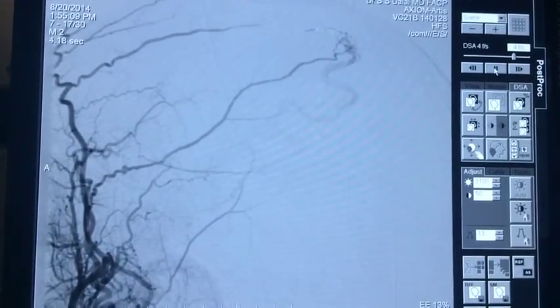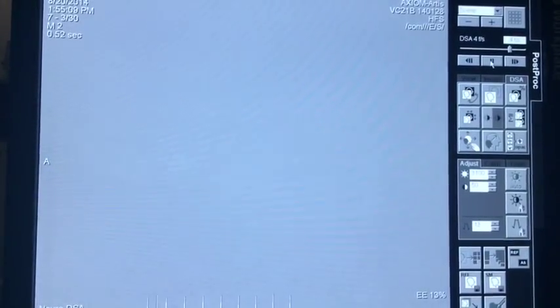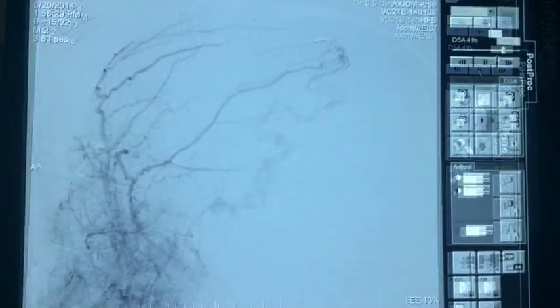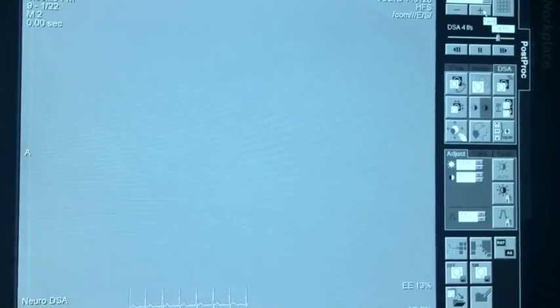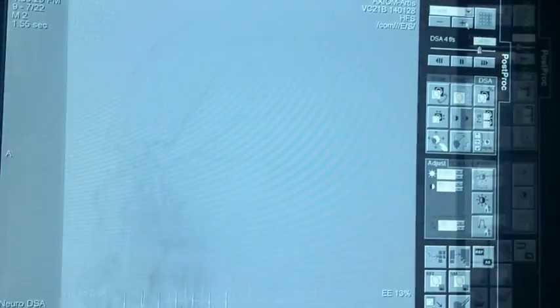But the fistula continues to fill from the middle meningeal artery. So we continue to inject Onyx on this patient. This is an oblique projection which shows the fistula still filling from the middle meningeal artery. We will try to embolize that.